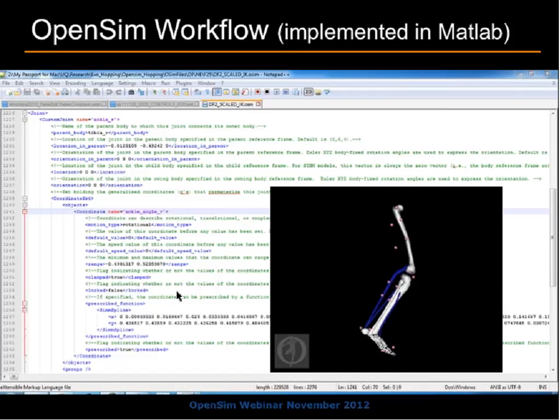In the first instance, we only had a limited number of muscles in the model, so we had no actuators driving hip motion, a limited number contributing to knee motion. And so we needed something to maintain the appropriate coordinates for the hip and for the knee. And then at the ankle, perhaps ideally it would have been nice to not prescribe the coordinates and just let the motion be driven by the muscles themselves only.